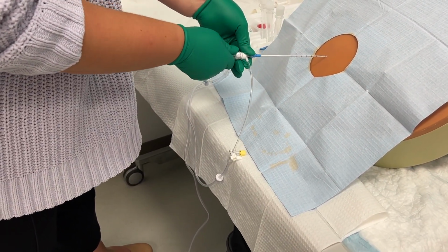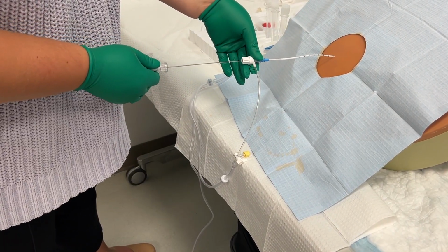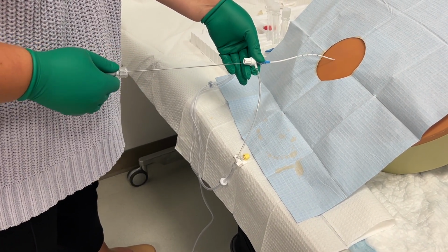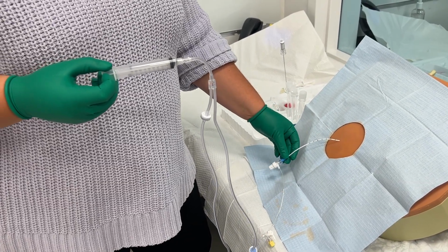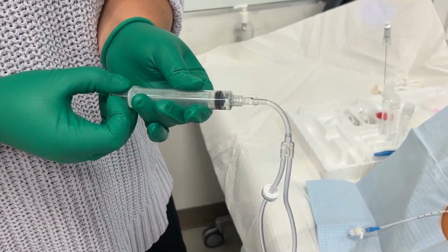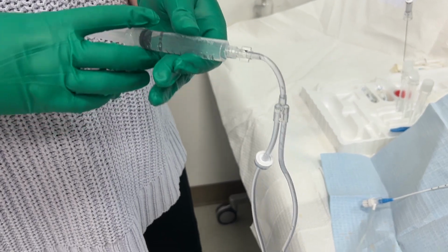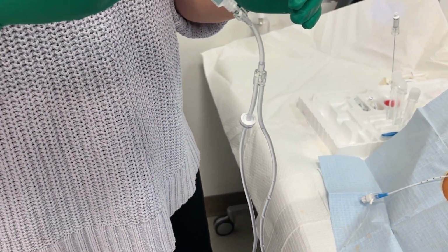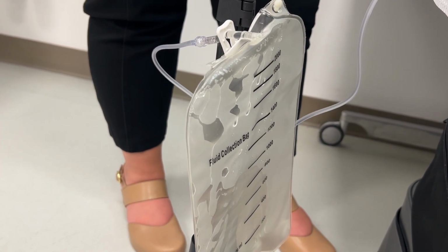Keep in mind that once you've removed the needle, it can no longer be inserted due to possibility of shearing the catheter during reinsertion. Now that we've removed the needle, we can relax the catheter or have a sterile helper hold it, and then use the syringe to aspirate the desired amount of fluid. The way the valve system works in this tubing, you can actually push the fluid back in and it will flow into the collection bag.